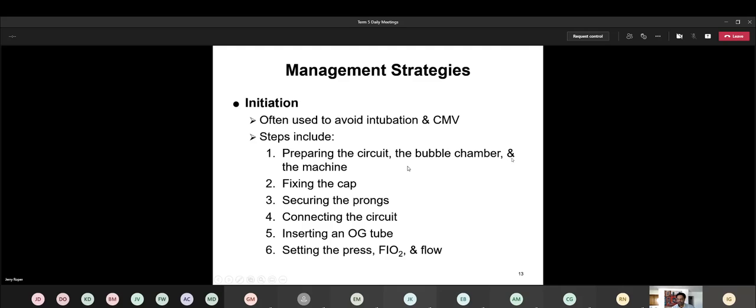All right, so now we know that when it comes to invasive versus non-invasive, we're always going to probably try to go with the non-invasive route first. And let's say that we've got a little baby who needs to have CPAP, then you're going to probably have options. You may have bubble CPAP units in your facility, and you may have infant flow systems that you could use. And then it may come down to your preference. You may have to decide, which one of these systems do I want to use?